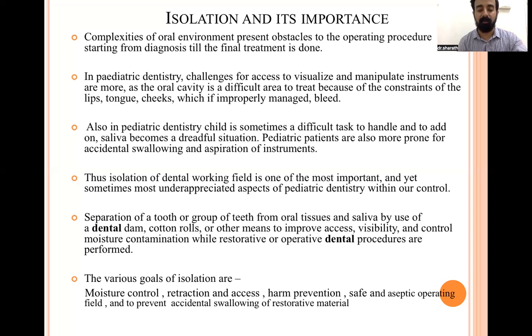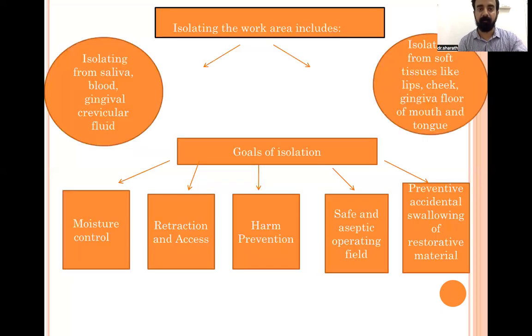We need to have moisture control, we need retraction and access. There should not be any kind of harm. It should be safe, aseptic, and to prevent accidental swallowing of any restorative material. So, as I said, this is a flowchart of the goals of isolation.